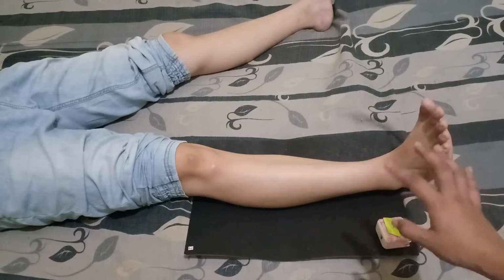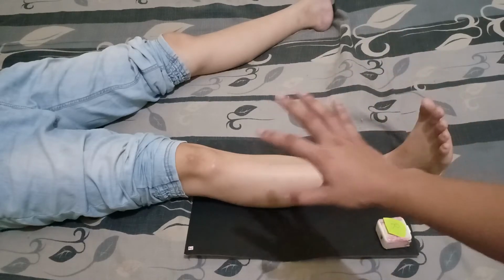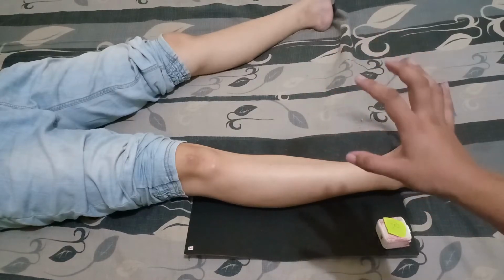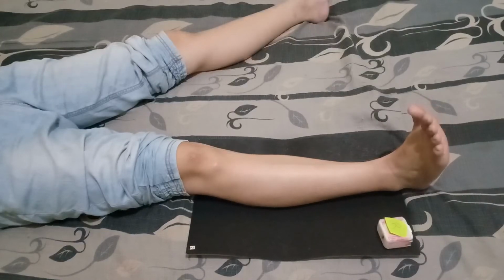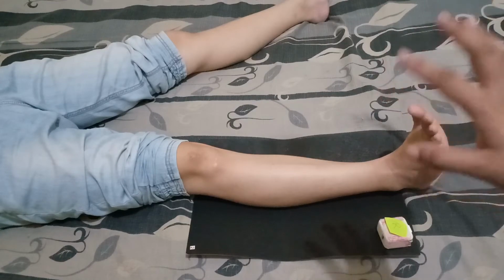Analog is 70 to 75 kV range, and for its digital system, it is 70 to 80 kV range. To make best use of the anode heel effect, place the knee at the cathode end of the X-ray beam. It has 200 mA and a time of 0.01 seconds.